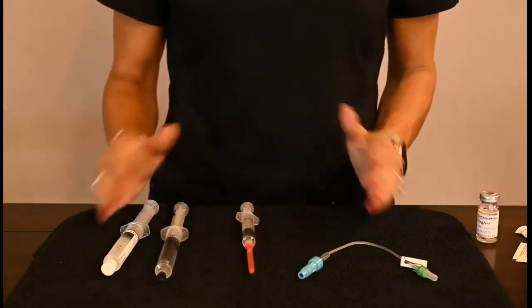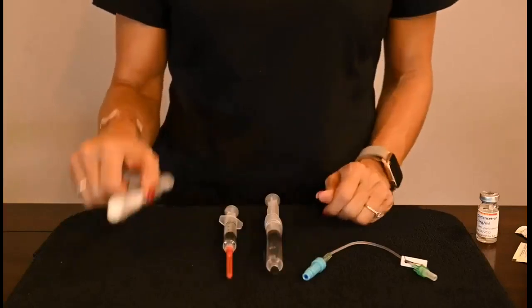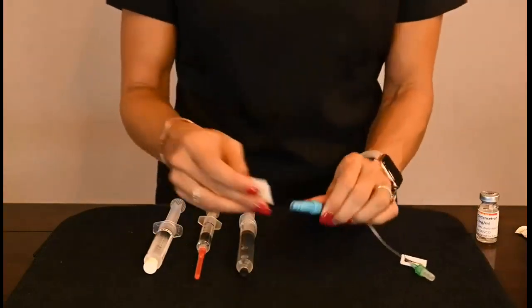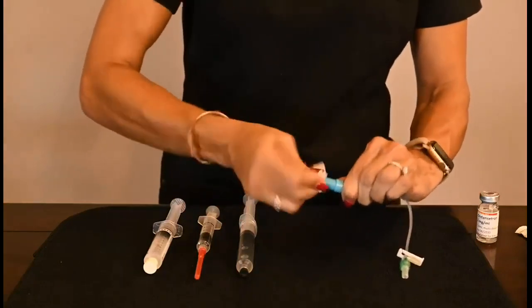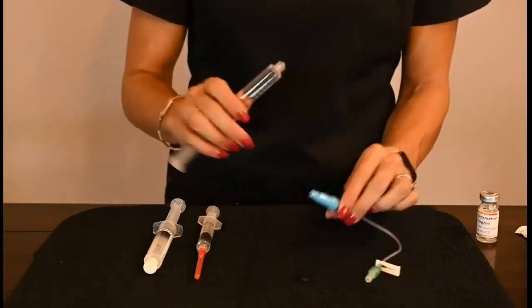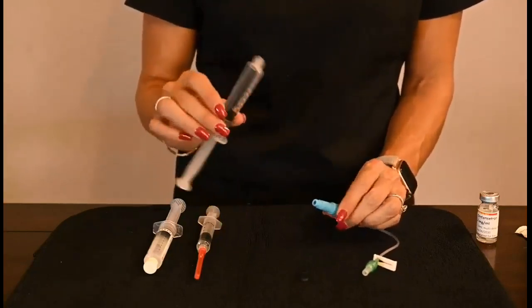Now we're going to do what's called the SAS, which means saline, administer the medication, saline. I would have my gloves on, I would go to the patient. I've already done my ID, my 5 rights, my 3 checks, like I said before. I'm going to scrub for 15 seconds. I'm doing it faster just for videotaping purposes. Then I would get my syringe, a pre-filled syringe of the normal saline. For a peripheral line, even though this is 10 mLs, you only need like 3 to 5 mLs.